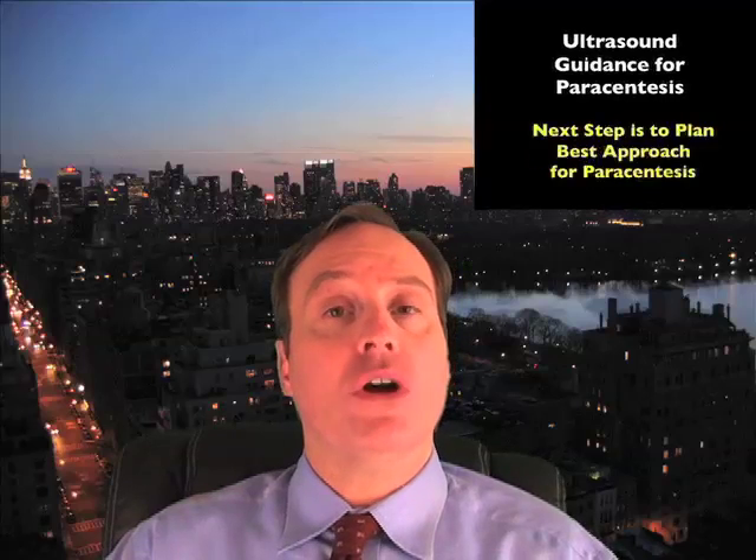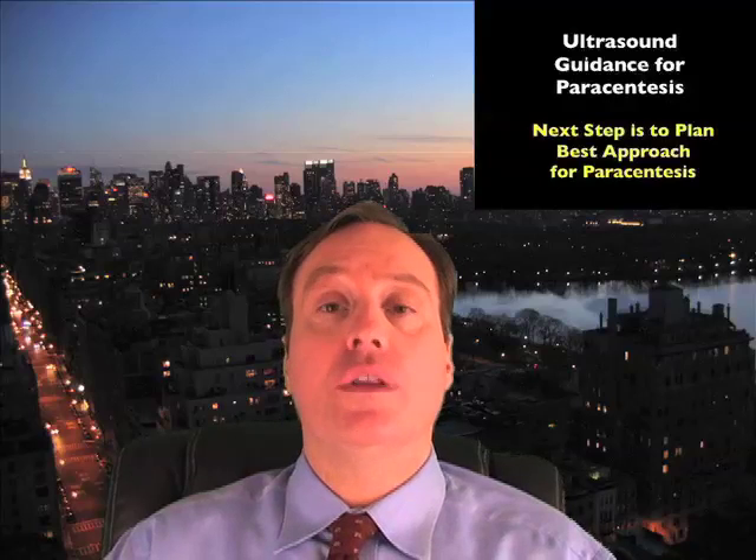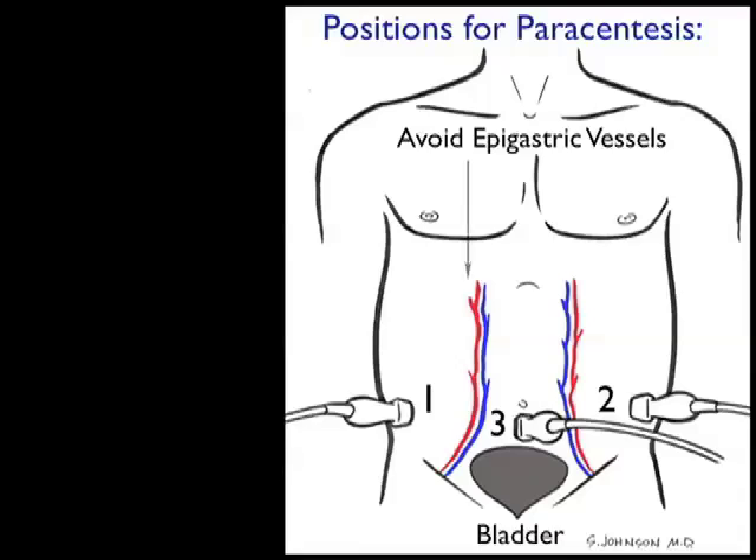The second step is to best mark the location for needle placement using bedside ultrasound. The two techniques that have been used in the past are the midline linea alba or the lateral gutter techniques. Using bedside ultrasound can allow you to decide between the two where the best location for needle placement is. This illustration shows the preferred positions for the paracentesis procedure.